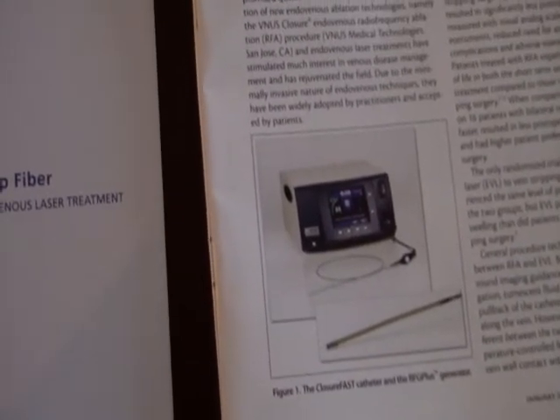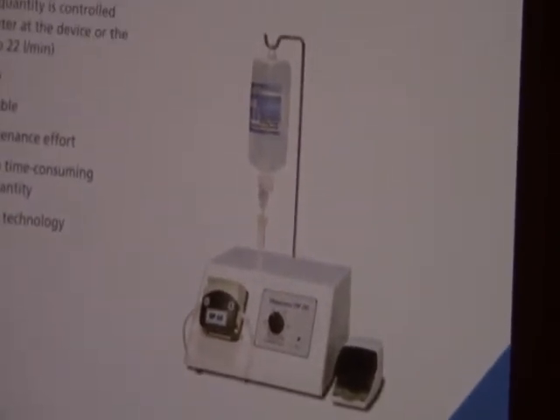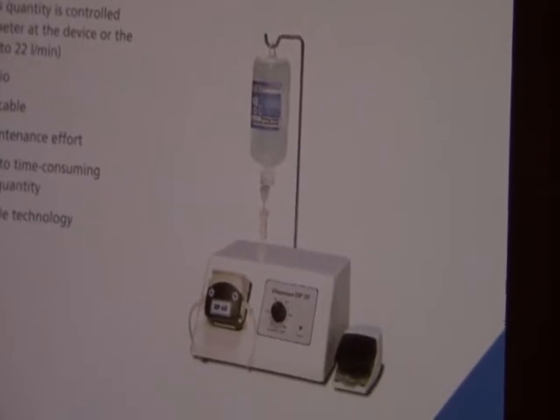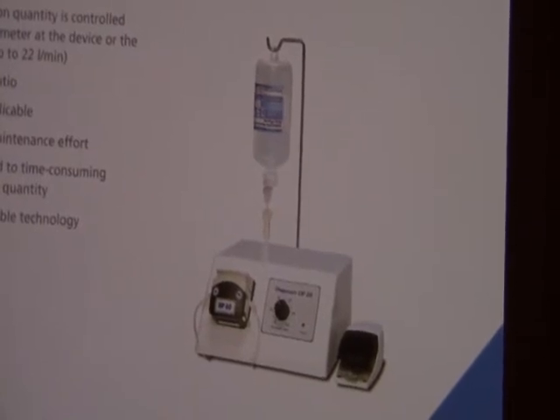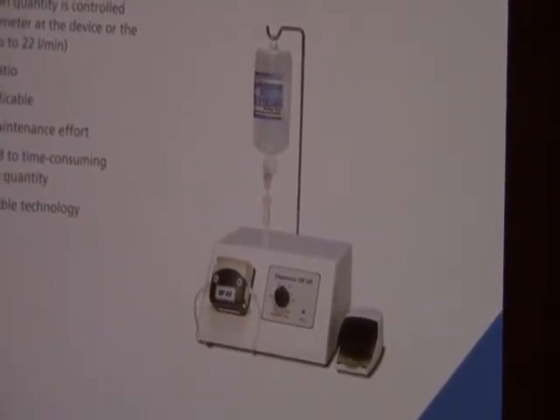The other important device used is the anesthesia pump. It provides local anesthesia along the course of the greater saphenous vein. This is important since the procedure is usually done under local anesthesia with the sedation. It also prevents burns, which can occur during the procedure.